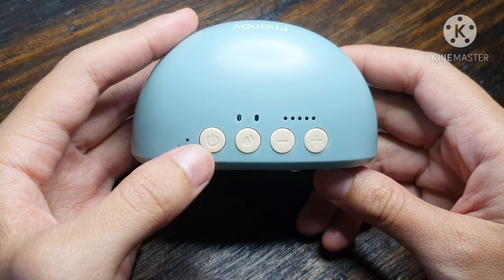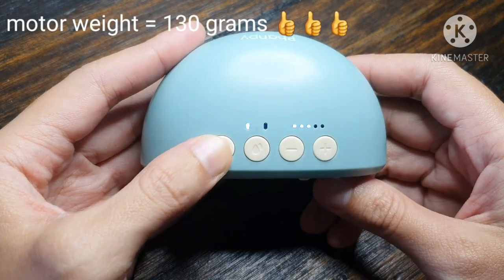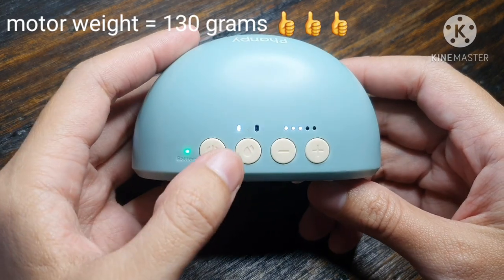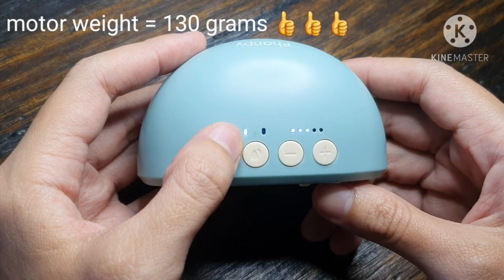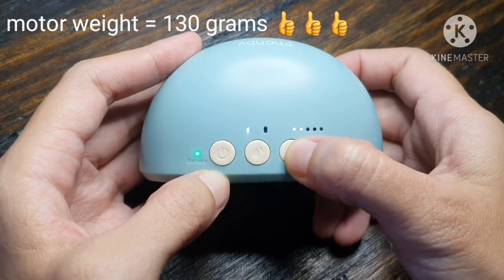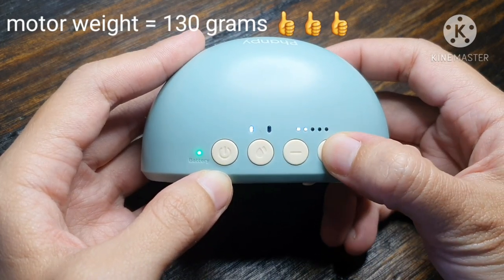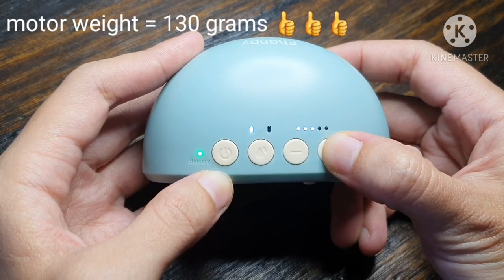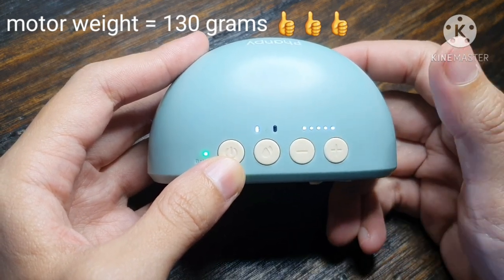Kapag i-on ito, press for 2 seconds — 1, 2. On na siya. Naka-stimulation mode na siya, for massage mode. Naka-level 3. So ito yung level 1, level 2, level 3, level 4, and level 5.